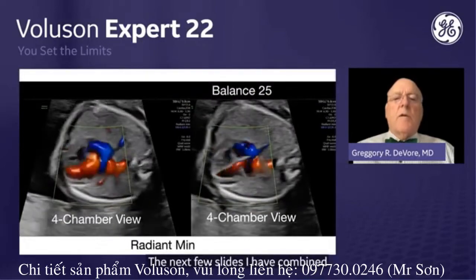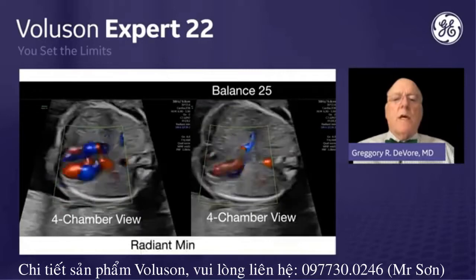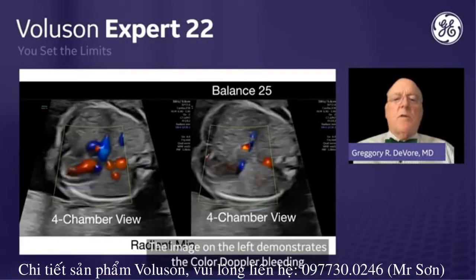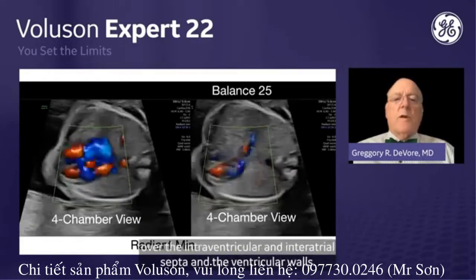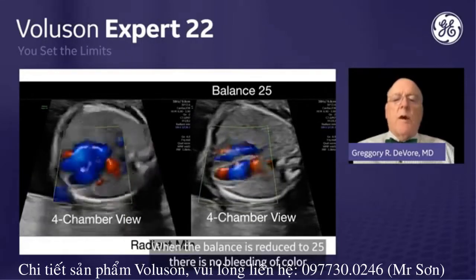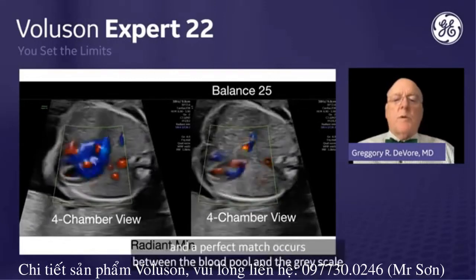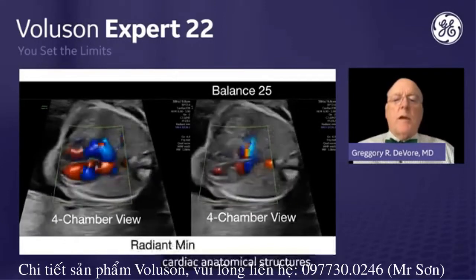In the next few slides, I have combined radiant min with color Doppler and decreased the color balance to 25. The image on the left demonstrates the color Doppler bleeding over the interventricular and interatrial septa and ventricular walls. When the balance is reduced to 25, there is no bleeding of color over the septum, and a perfect match occurs between the blood pool and the grayscale cardiac anatomical structures.